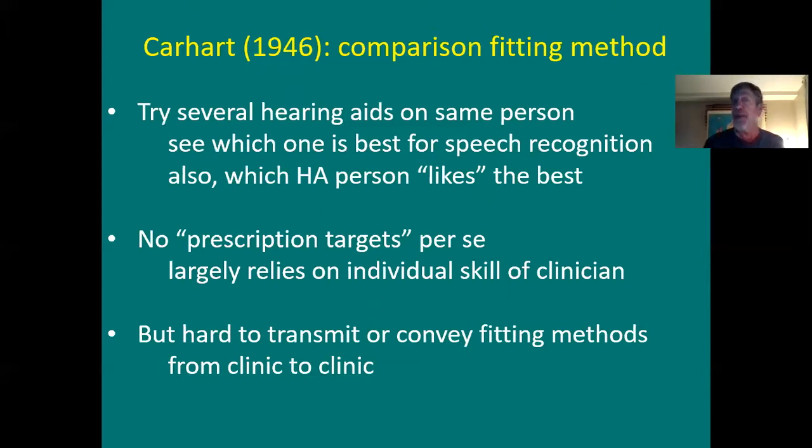So this was way back. I mean, they weren't even trying to shape the frequency response of the hearing aid at all. And also which one the person liked the best. That must be because all hearing aids were body aids way back. No prescription targets per se.